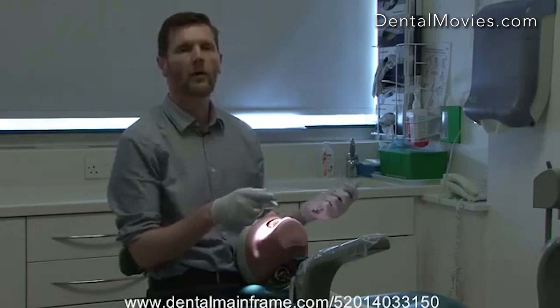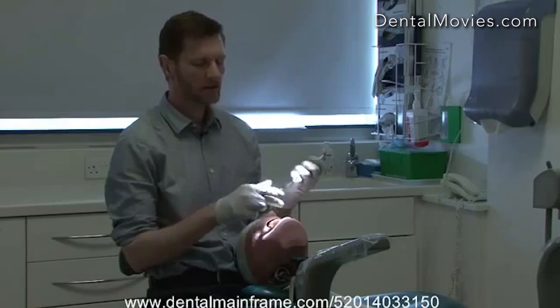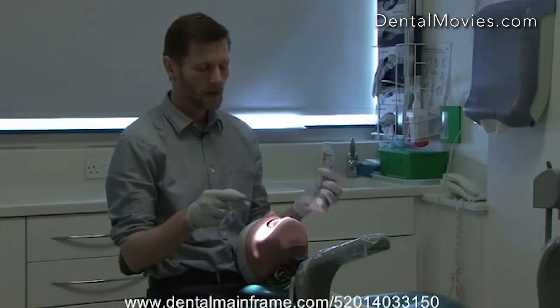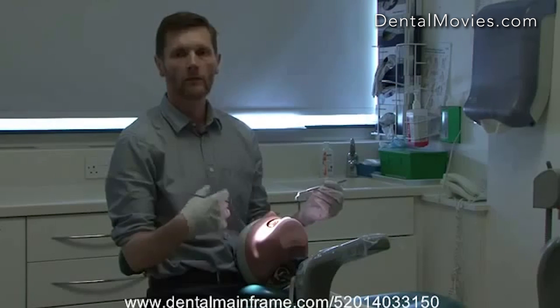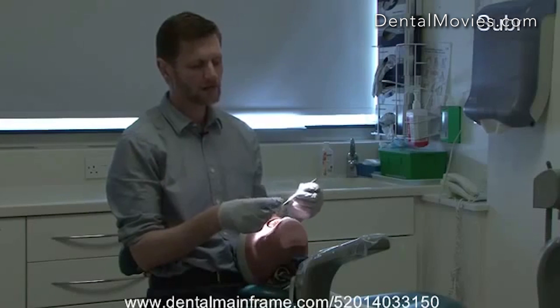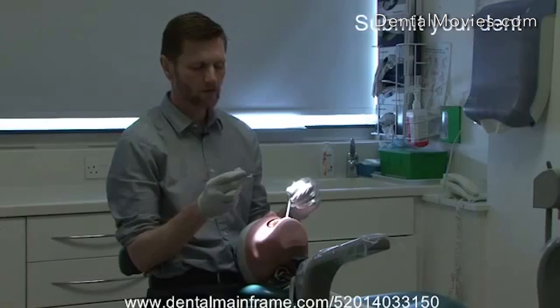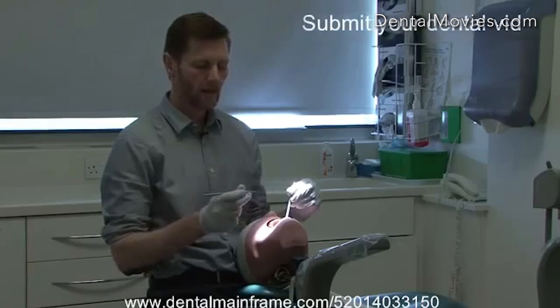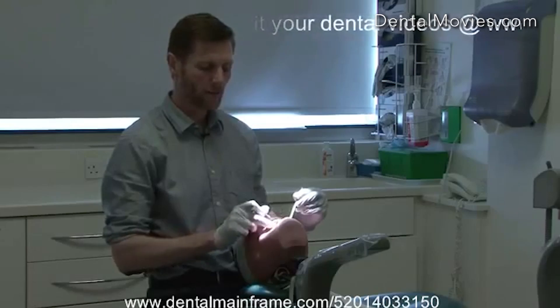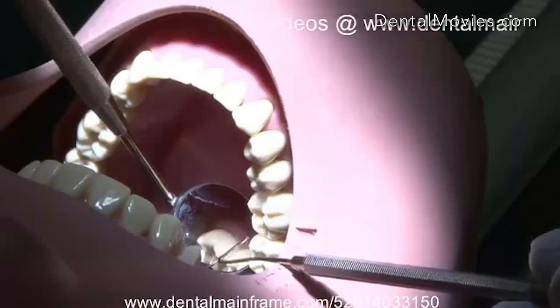The other useful technique is when looking at the lingual surfaces of the lower teeth, where the tongue is liable to get in the way. In these situations we can use the mirror both to give ourselves vision and to retract the tongue. If we actively try to pull the tongue out of the way, the patient usually pushes against the mirror and it causes a lot of stress. Instead, hold the top of the handle of the mirror, place it on the lingual surface of the lower teeth against the tongue, and just lean it backwards — you don't actually have to push the tongue too far. This brings the lingual surfaces into your line of sight while protecting the tongue.